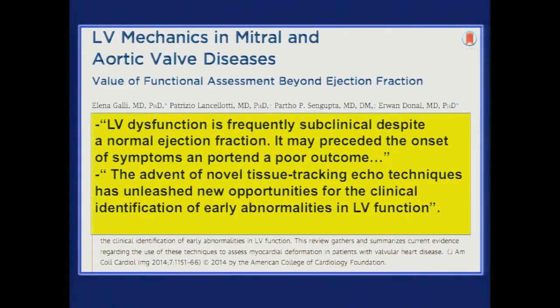LV mechanics in mitral and aortic valve disease. LV dysfunction is frequently subclinical despite a normal ejection fraction. We've talked about that. It may precede the onset of symptoms and portend a poor outcome. And so the advent of these novel imaging techniques has unleashed, as they say, new opportunities for the clinical identification of early abnormalities of LV function. And so we may be looking at new paradigms in terms of timing of intervention in patients with valve disease based on these new parameters of ventricular function, here myocardial imaging.